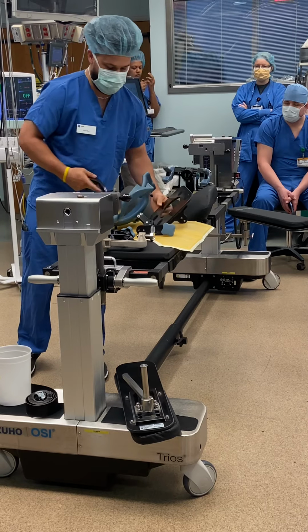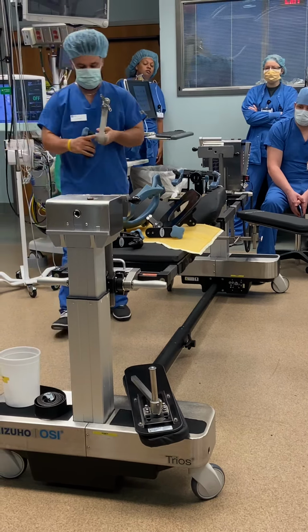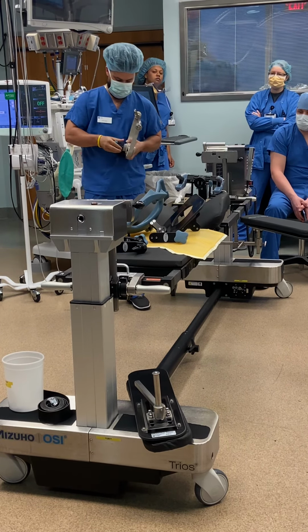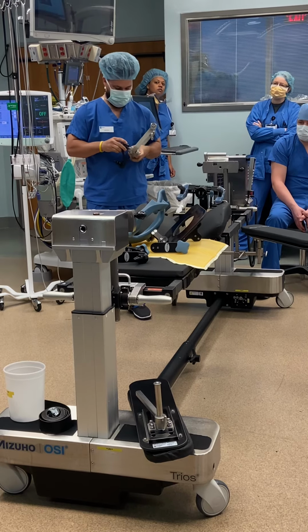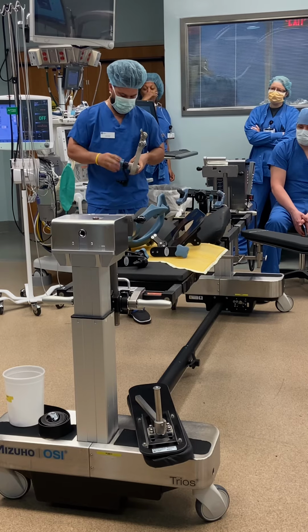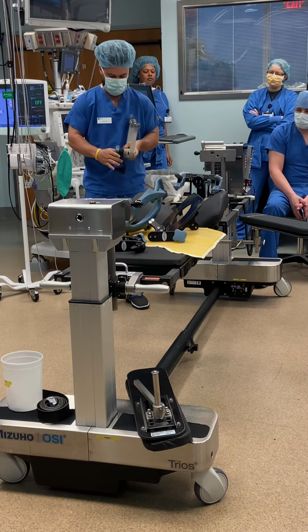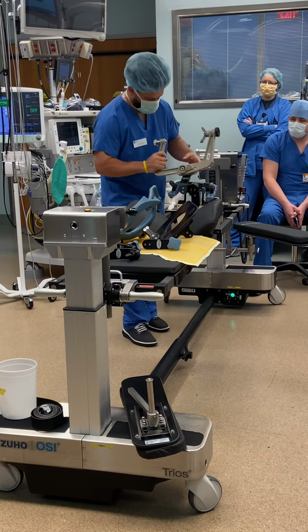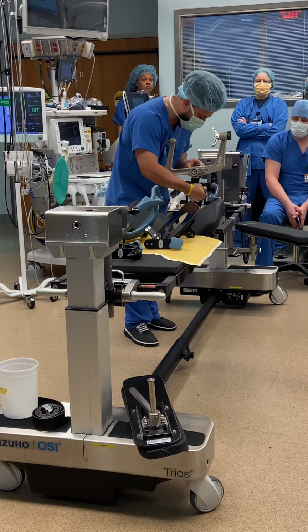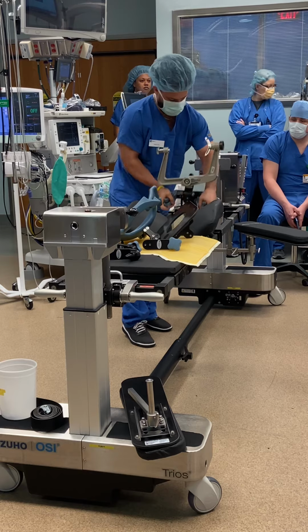So with the Starburst attachment, this is where the workflow comes in a little bit. We have these little blades right here that can form the same way. Come in right here, screw it in. You want to screw it in all the way until there's no more play with it. Obviously you want to make sure it's secure. Perfect. Then you put it in the same exact way, wait till you hear the click, and you're ready to rock, just like that.